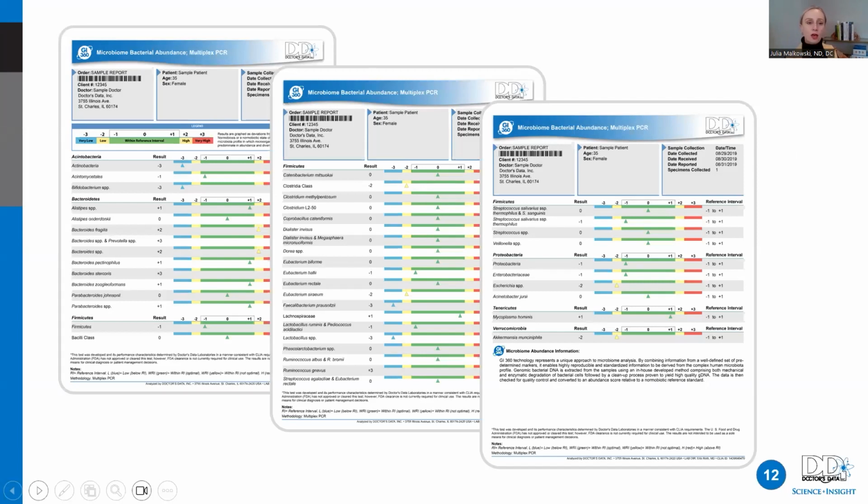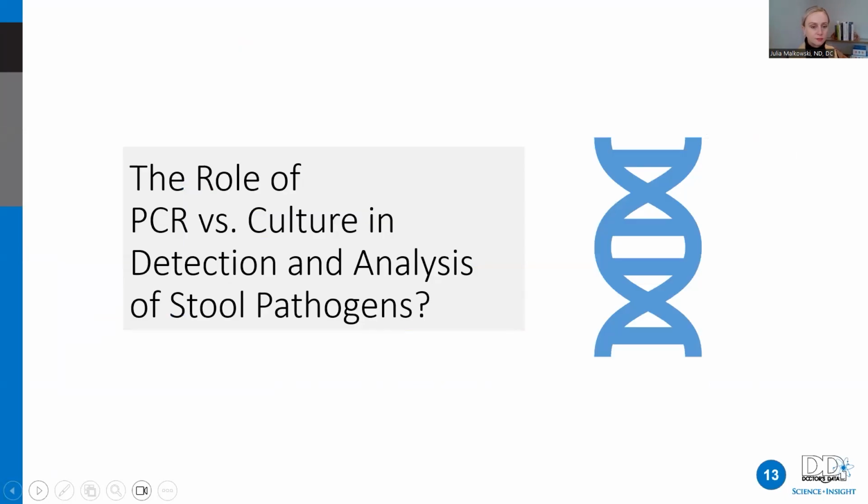Here's an example of the microbiome abundance and diversity information that we have been discussing, and this is the detailed information seen on pages 2, 3, and 4. Recall, this is going to be represented in page 1 in the functional guilds, the web, and the dysbiosis index and the diversity score. But here we have the key findings as an example that Akkermansia is listed here. And we'll see this again in the cases.